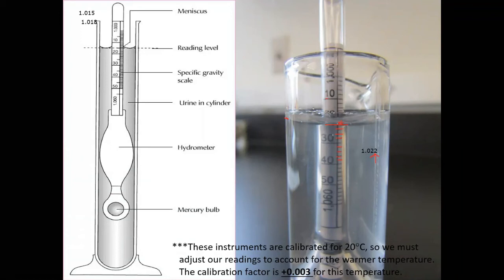Okay, make sure that you fill in all of this information and then look back at all of the results that you have, both from the testing strips and the specific gravity readings and the physical characteristics that you looked at before. And what you're pretty much going to do is look for the values that aren't exactly normal, the ones that are kind of outside the normal range, right? And so, for example, if there is high glucose, you shouldn't see any glucose within the urine in a healthy individual. And so glucose might indicate that the individual has diabetes, for example, okay, or some kind of condition related to diabetes.